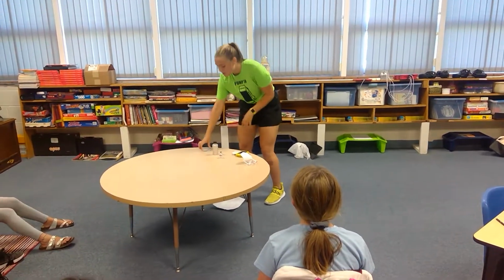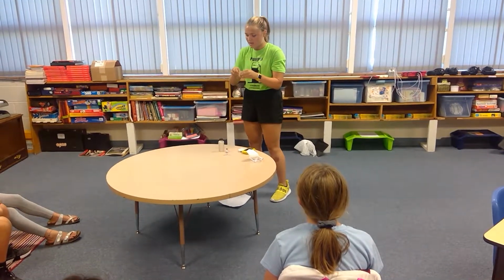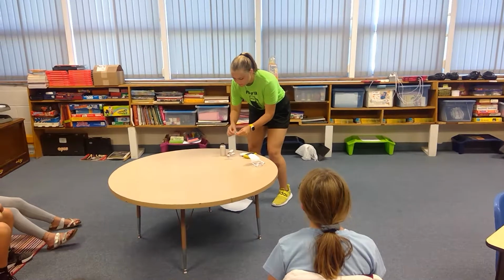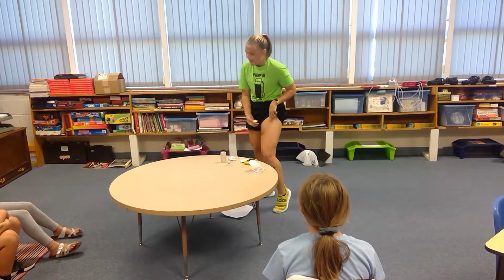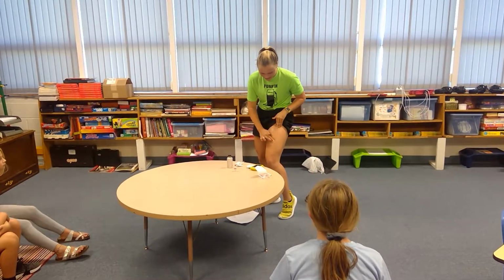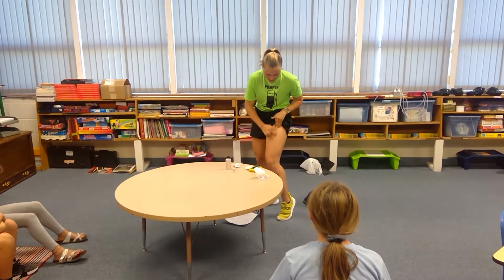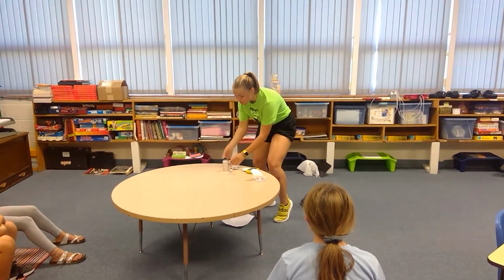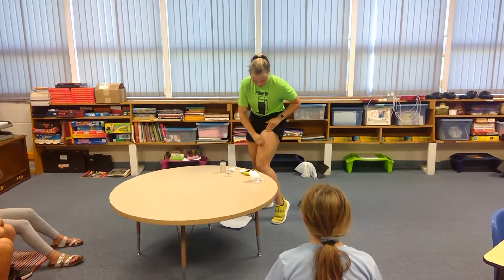While we're doing that, I'm going to choose another spot on my body to put this. So with the alcohol wipes, I'm going to open those up. And today I'm going to put it on my leg. So why we clean our site is because your body has oil on it. And so to make sure the pod stays clean and that nothing is infected, we clean it. You can see, even though I shower and we clean, our body is still going to be really dirty.